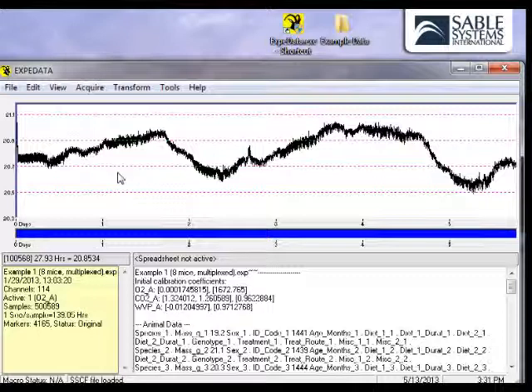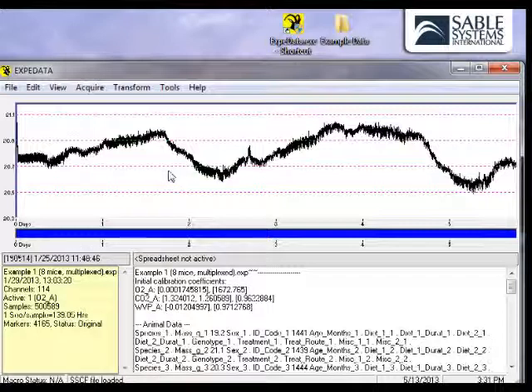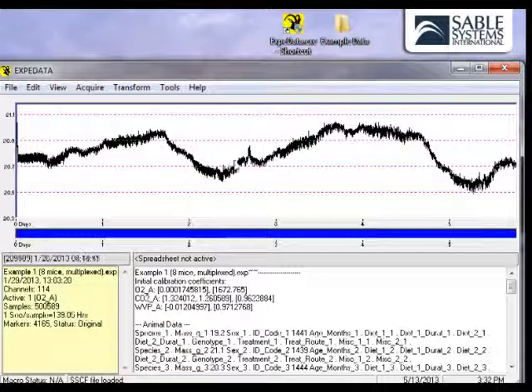Obviously, you will often want to know more than that, such as the exact date and time at the cursor. To find that out, simply hold down the Ctrl key while you move the mouse cursor. As you can see, the exact time and date at which the cursor is positioned will be shown.